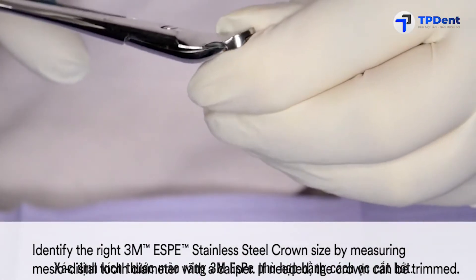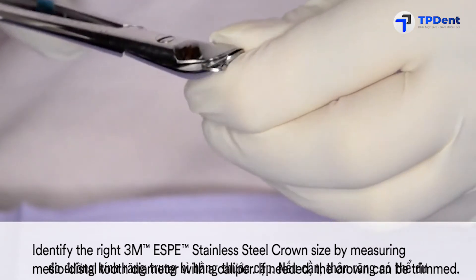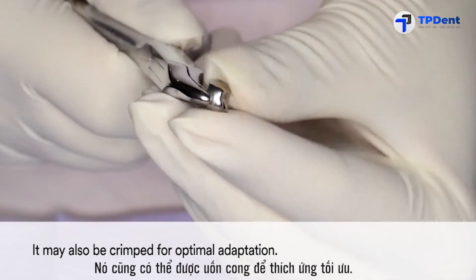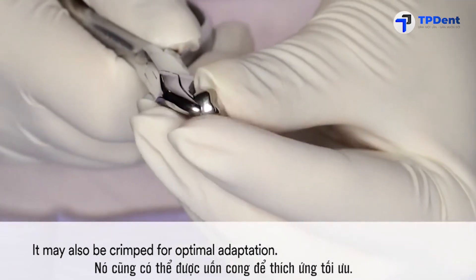Identify the right 3M stainless steel crown size by measuring the mesial-distal tooth diameter with a caliper. If needed, the crown can be trimmed. It may also be crimped for optimal adaptation.